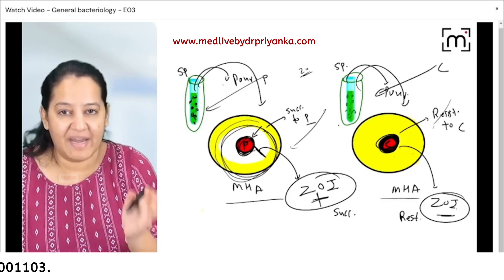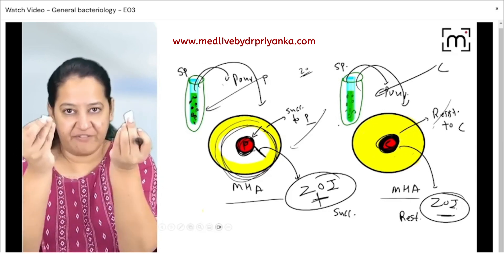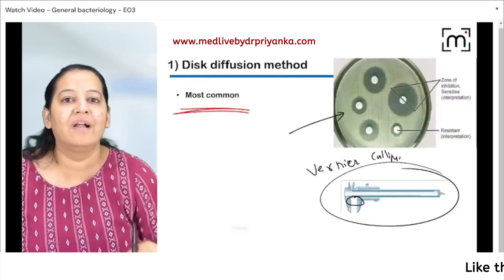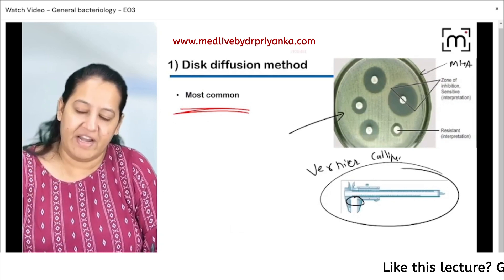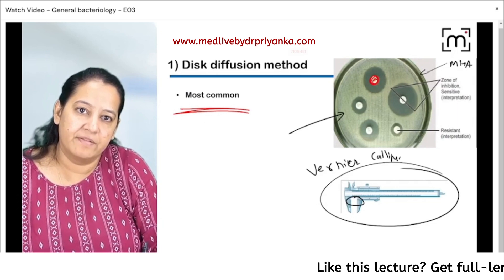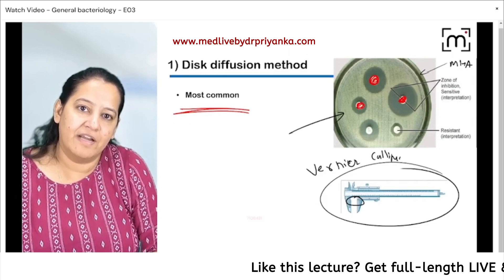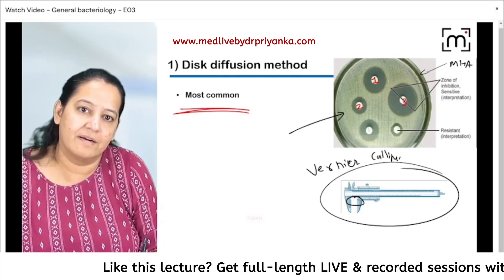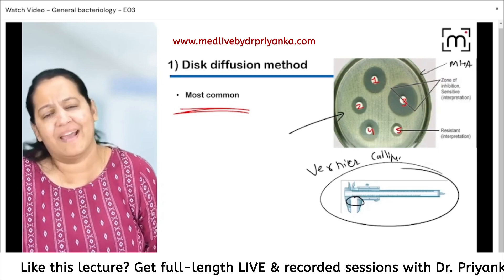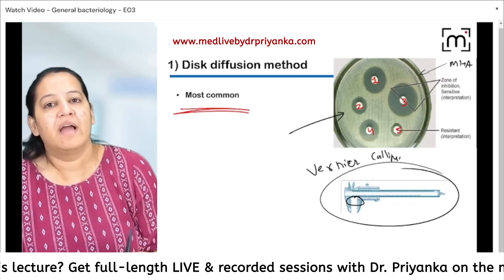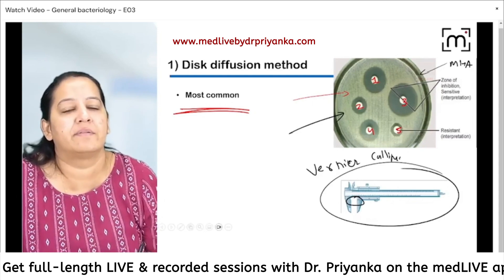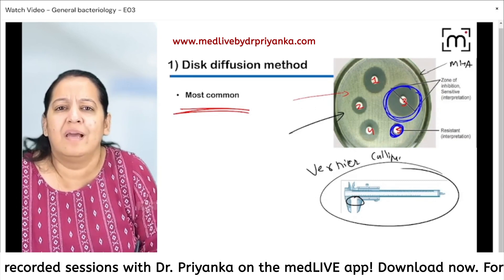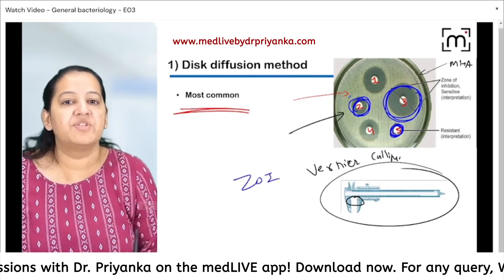Now you may ask: if I want to test 20 antibiotics, do I take 20 different plates? No — you can take 20 different circular filter paper discs and arrange all of them on one single Mueller-Hinton agar plate. I take different antibiotic filter paper discs — first antibiotic, second antibiotic, third, fourth, fifth — one may be penicillin, one is cephalosporin, one is aminoglycoside, and so on. You can see the whitish-yellow color colonies in the background. Here I get a big zone of inhibition, here nearly no zone, and here a little bit intermediate between the two.